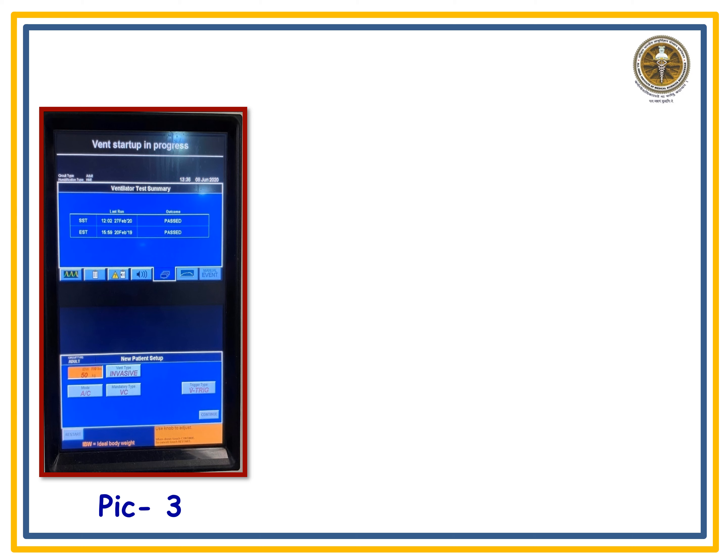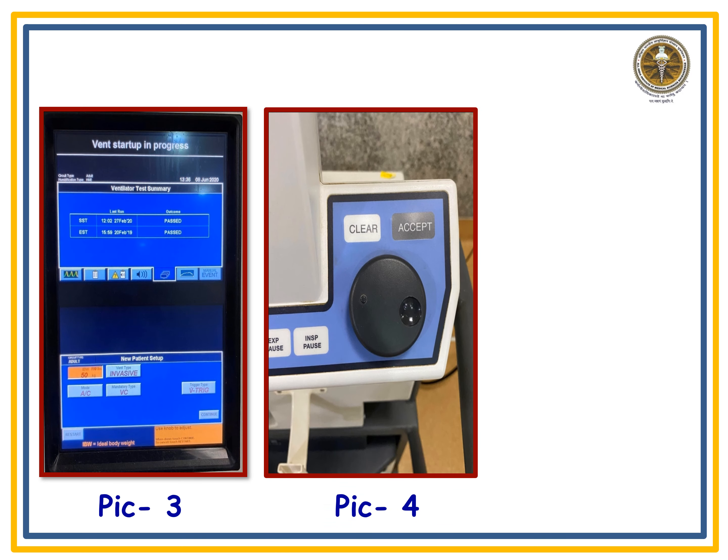Here I have chosen assist and control mode, controlling the tidal volume of the patient. To adjust parameters, use the knob — a black round button on the ventilator. Rotate it clockwise to increase a parameter range and anti-clockwise to decrease it. Once you have accepted the values, all settings will be finalized for your patient.